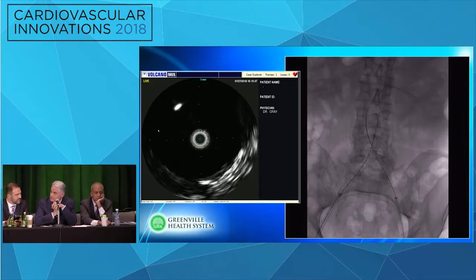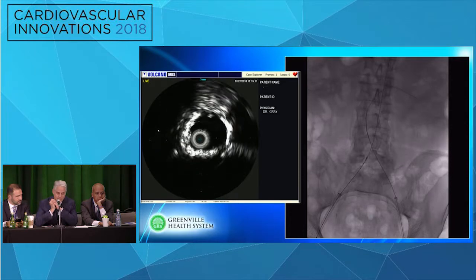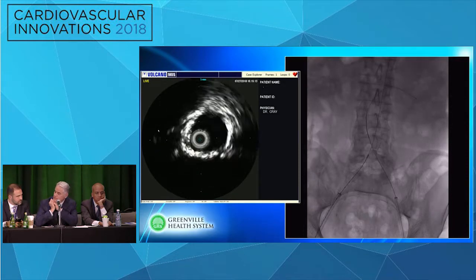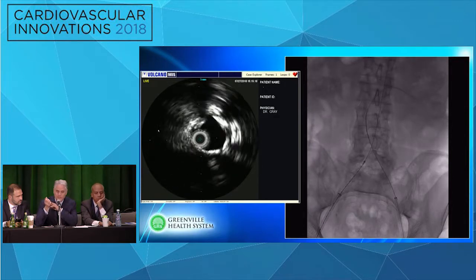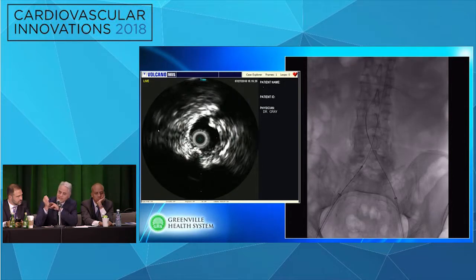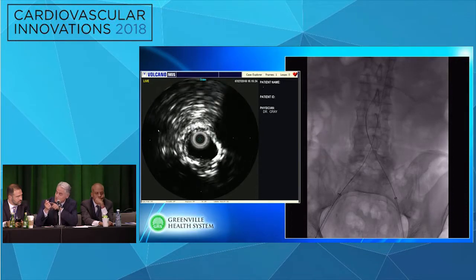He does a ton of aneurysms, as you know, and Venki loves to use IVUS on all of these. There's our aortic bifurcation, with the Phillips system. And he does it for two reasons. Number one, just to make sure of the sizing. Now we're on our common iliac here. CAT scan images and IVUS images, and in a moment you'll see what our internal iliac comes off at. At the time of the implant they are actually saying the same thing in terms of diameter.